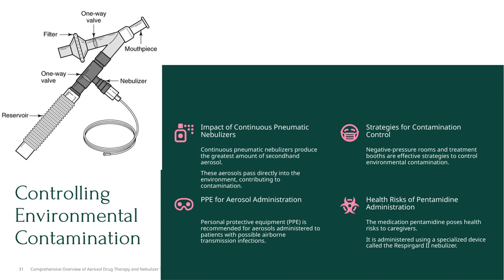Next, we'll look at the impact of continuous pneumatic nebulizers. These devices generate a large amount of second-hand aerosol, because they produce a continuous flow, which means more aerosols are released into the room. These aerosols pass directly into the environment, increasing the potential for contamination and exposure for healthcare workers and others nearby.